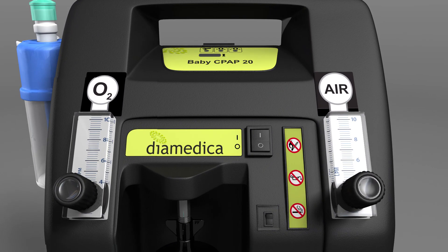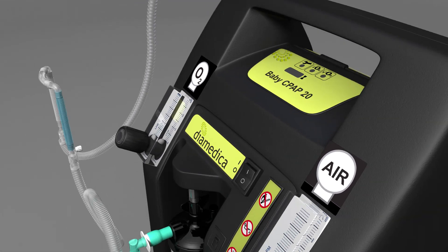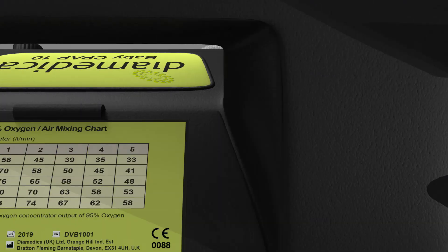Up to 10 litres per minute of oxygen and 10 litres per minute of air are controlled by separate flow meters, allowing a variable gas mixture to be delivered to the patient. The gas mixture can be adjusted from 21 to 95% oxygen as determined by the chart.